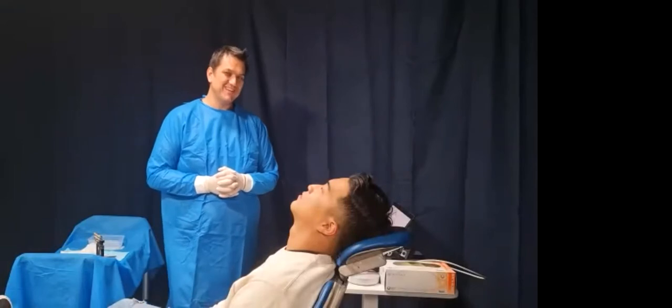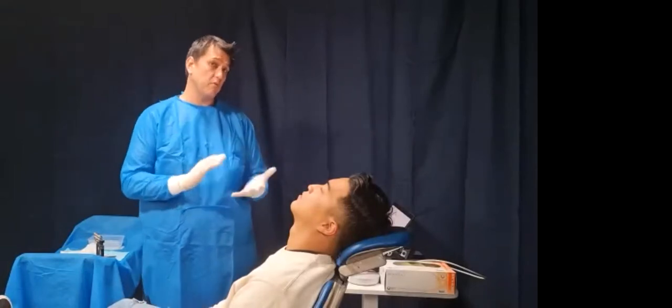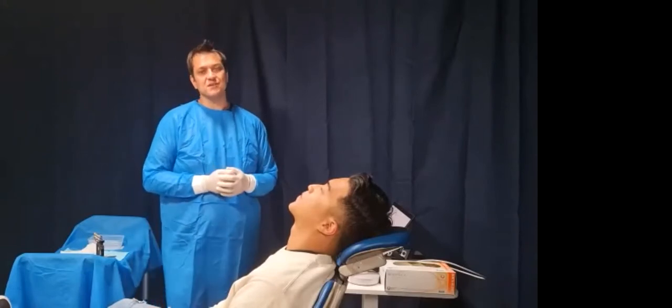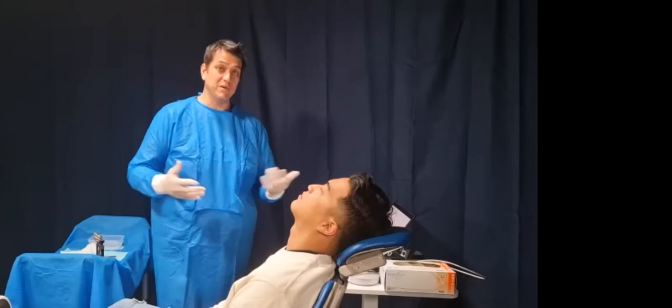Okay, now we're ready to do our practical component like usual. And this week, we've got some exciting things to do. So I'll walk you through what we can actually do today. The first thing is we've been very privileged again to have a live patient, which is a fantastic thing to have when you want to demonstrate exactly what it is that we do in clinic.